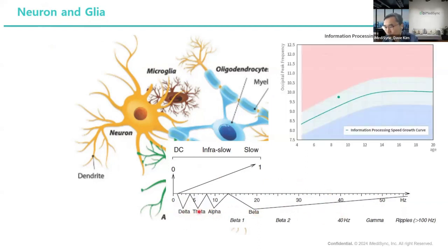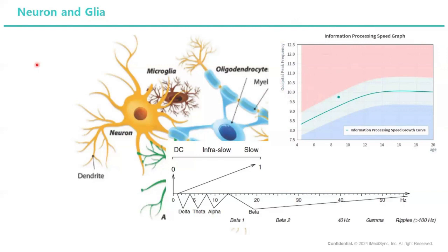Today I want to focus on this neuronal EEG rhythm. I mentioned before the EEG alpha peak. This is alpha peak frequency. Some participants do not understand alpha rhythm very well, but I will explain it later.